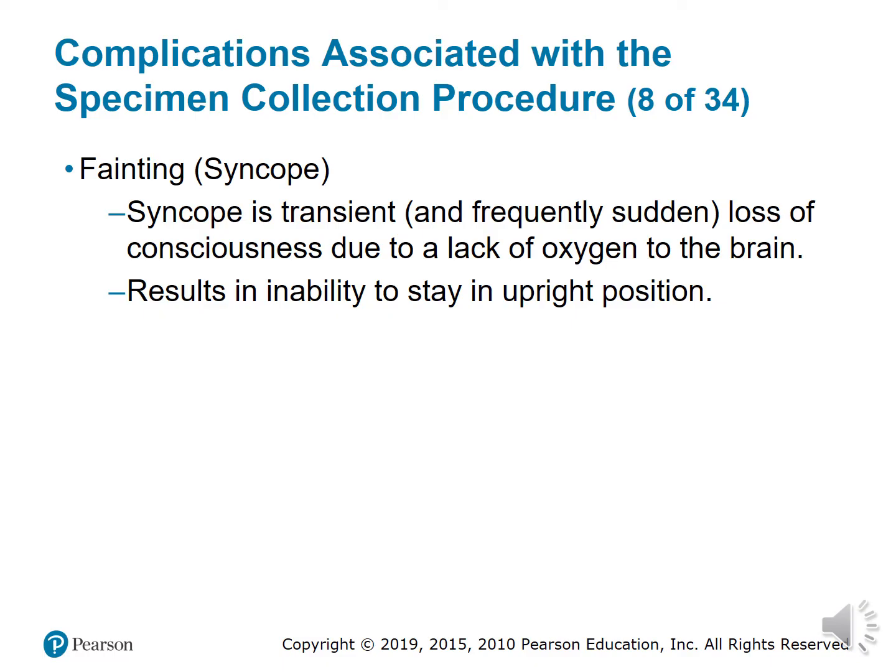Most of them who know they pass out when getting labs will reassure you before you even ask. If you do work in an outpatient situation, we always have some type of cold towel compress or ice to make a cold compress, and we always have juice or water, or sometimes crackers, to help build up their sugar level. It helps them get a sugar rush so their red blood cells can pump it into their body and get their color back into their system.